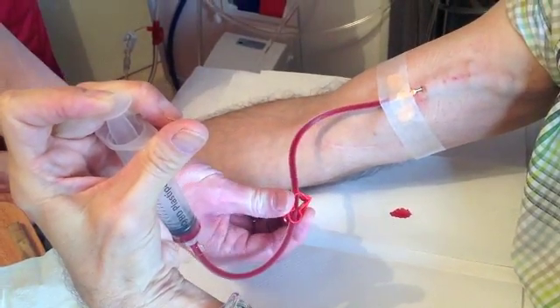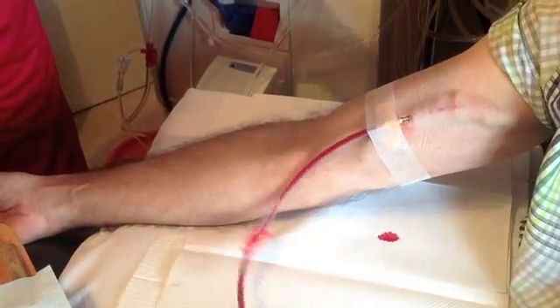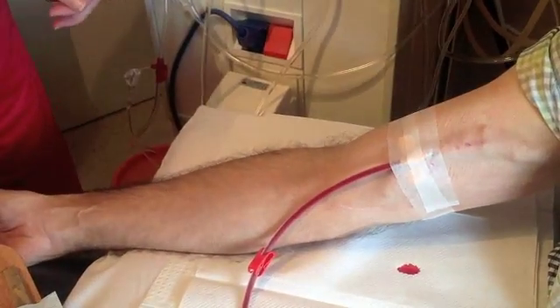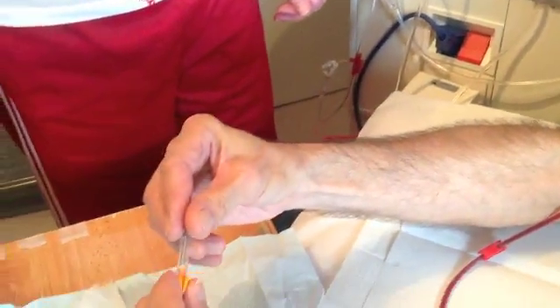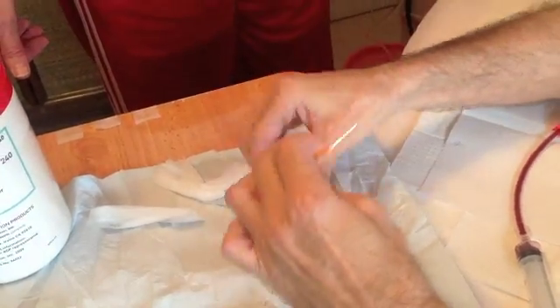We then clamp that off and put on number two of the five, here with the second part of the needle. And that's the first needle done. Next we'll take the blue needle, pulling back the wings and removing the cap.